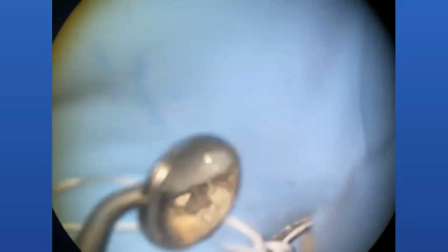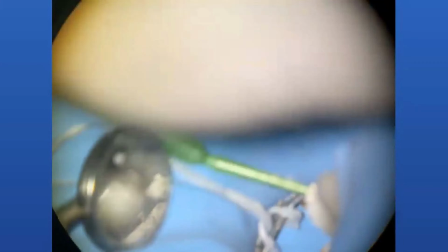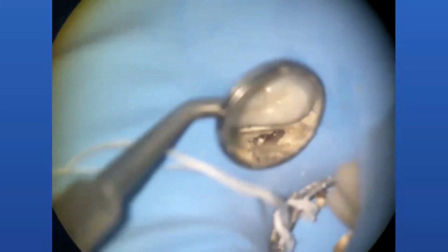What I'm doing here is, now that I've removed the tissue down to bone, I'm applying Cavit, which is not moisture sensitive, it's actually hydrophilic, in order to block off the interproximal area in between the tooth that I'm treating and the tooth in front of it. So that will allow us to get a really, really dry margin. And with a really dry margin, we're going to have better adherence of the SoundSeal. So now that I've created that isolation, I'm not getting any seepage of blood or saliva coming onto the preparation.